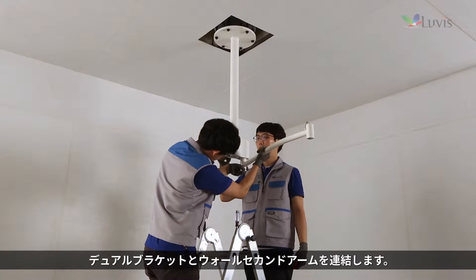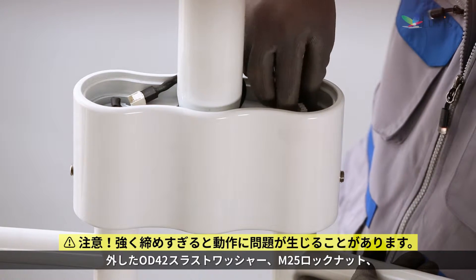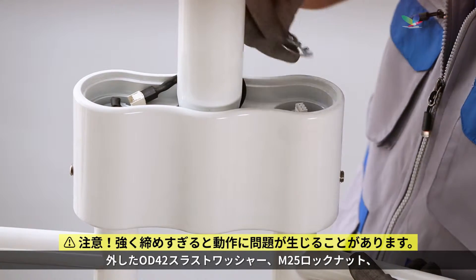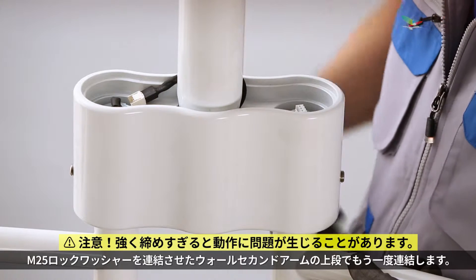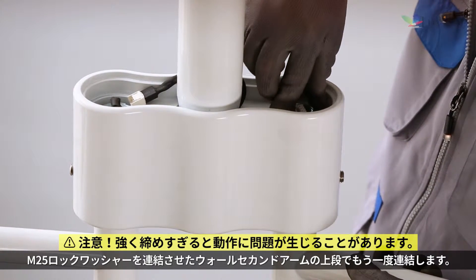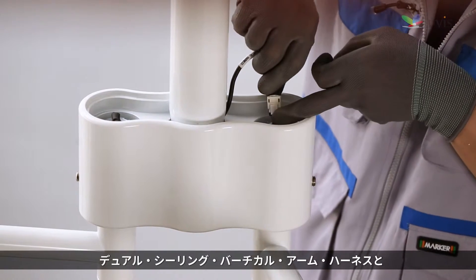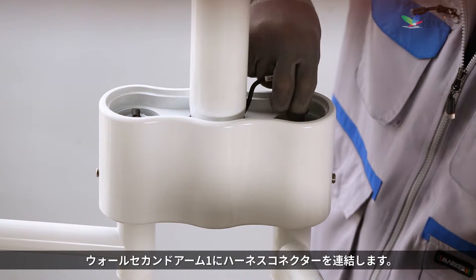Attach the wall second arm to the dual ceiling vertical arm. Then attach the disassembled OD42 thrust washer, M25 lock nut, and M25 lock washer to the top of the attached wall second arm. Connect the harness connector to the dual ceiling vertical arm harness and the wall second arm harness.